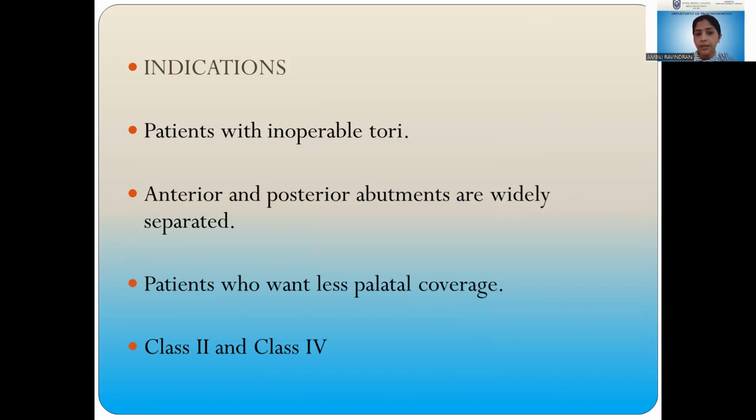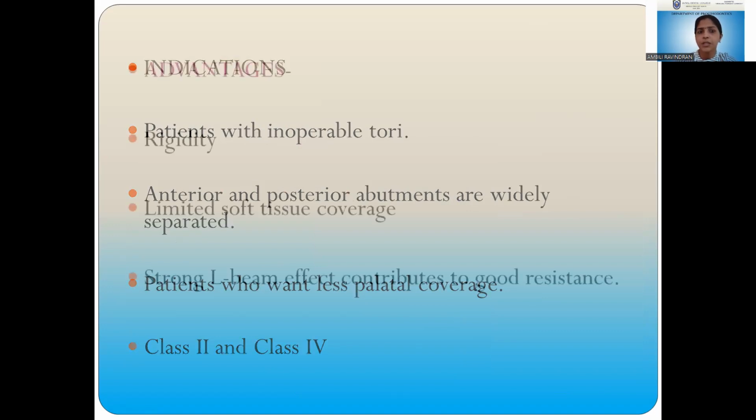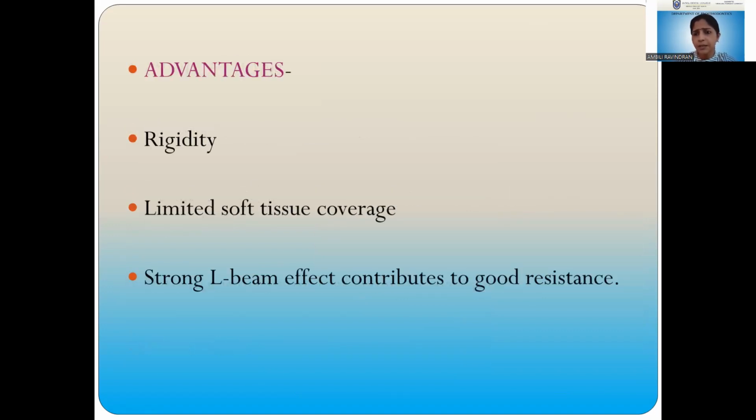Coming to the advantage, it will provide excellent rigidity with limited coverage of tissue, and an L-beam effect will be there. What is an L-beam effect? The two palatal bars are running in two different planes, which will produce extremely good rigidity to the prosthesis.